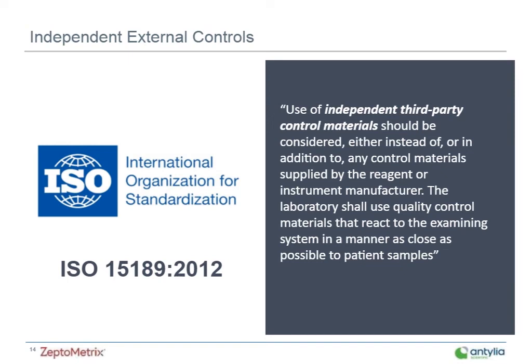If you're relying solely on in-kit controls, you have to keep in mind that those are really optimized to function with specific assays, specific platforms, and reagents. So obviously you can see that it could introduce a little bit of a bias. So it's critical to use well-designed, independent, and unbiased third-party QC controls in addition to, I know they say in lieu of, but really I think ideally you'd like to use them in addition to in-kit controls, especially full process controls, because unlike with synthetic control that might only contain part of the genome, each of the extraction, amplification, and detection steps is fully controlled in an unbiased and thorough manner.